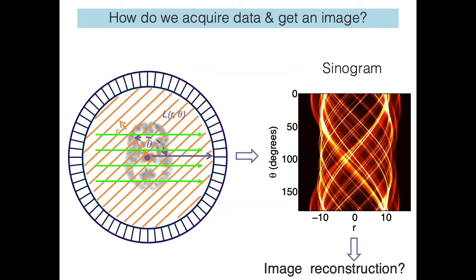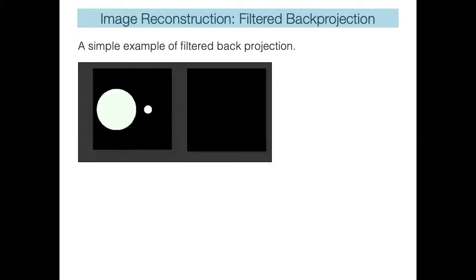So once you have your sinogram, you then need to reconstruct this in order to actually receive an image that's biologically relevant. And for the sake of completeness, I'm just going to mention filtered backprojection. This is how traditionally images were reconstructed. Nowadays it's usually done with an iterative algorithm, but conceptually speaking, filtered backprojection is easy to follow.